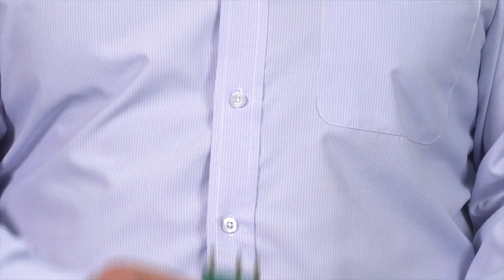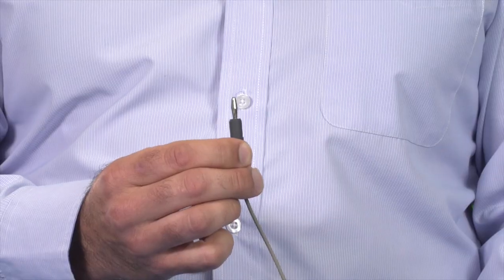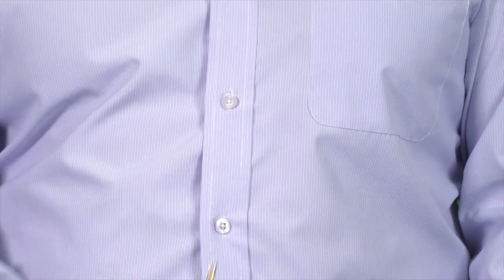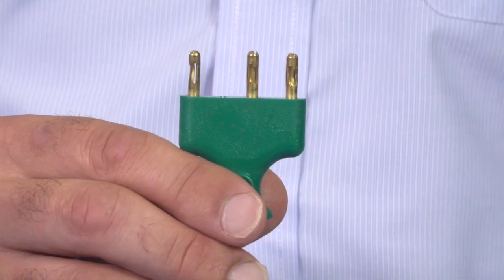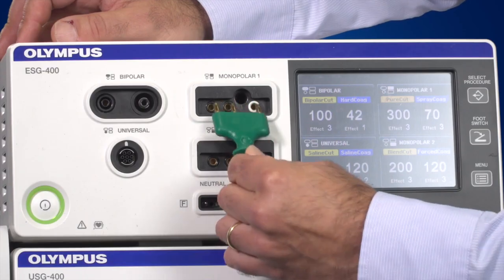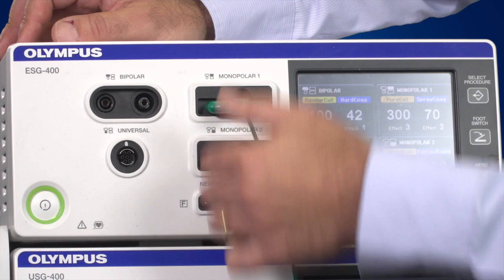The most common monopolar plugs include the three-pin international standard plug, the four millimetre banana plug, the eight millimetre Bovi standard plug and the five millimetre Urbi standard plug. The most common plug is the three-pin international plug. If you use the three-pin international standard plug, you can only connect it in one direction. This can be plugged into either a monopolar one or a monopolar two socket.